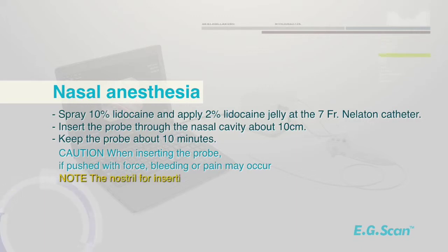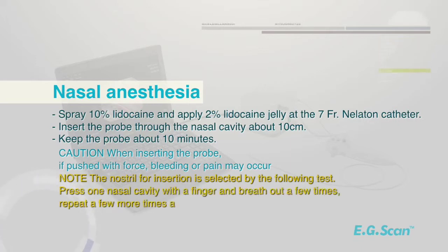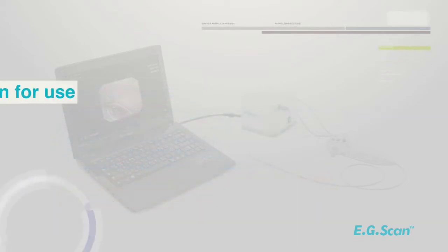Note: the nostril for insertion is selected by the following test. Press one nasal cavity with a finger and breathe out a few times. Repeat a few more times and select a well-ventilated nasal.